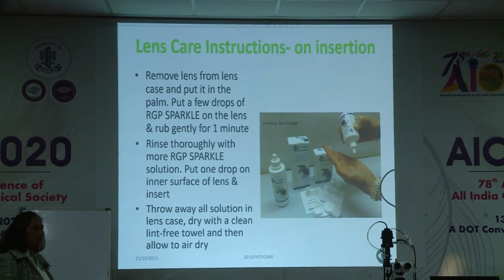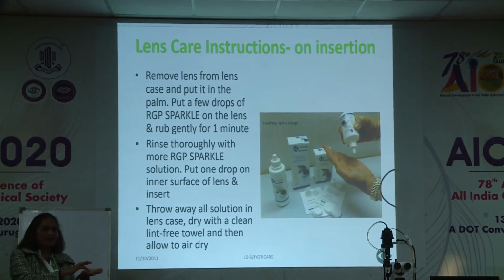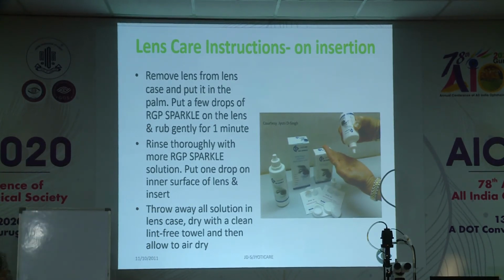Now lens care is very important. What I tell my patients on insertion is to remove the lens and put it in the palm of the hand, put a few drops of RGP Sparkle, the multi-purpose solution, onto the palm and give them a good rub and rinse, and then pour more solution on top of it to give them a further rinse to remove all the debris from what you have rubbed with, and then you put a drop of RGP Sparkle onto the lens and you insert that. RGP Sparkle is not only the disinfecting and cleaning agent, but it also has a cushioning effect. So the lens will feel immediately better on insertion.